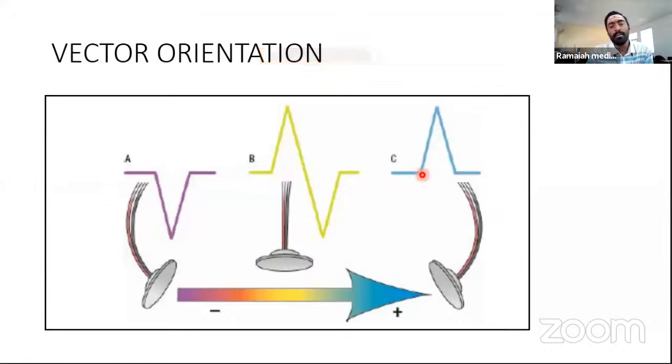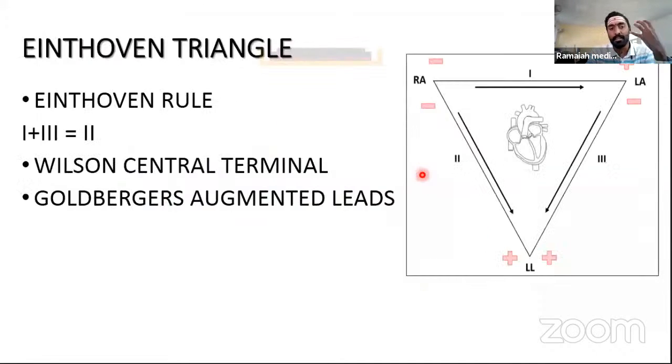So with this, we will see how the heart is going to pick up these electrical signals. To understand that, we come to this very, very important law called the Einthoven's triangle. Imagine the heart in the center, and we place two electrodes, because we want to look at the electrical activity across the right arm and the left arm.